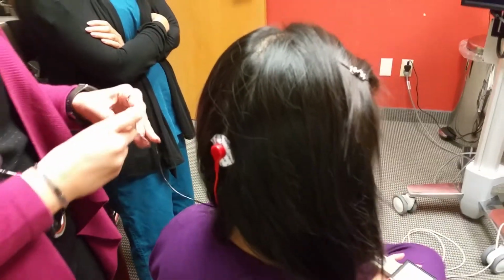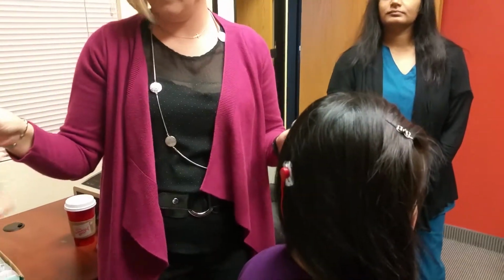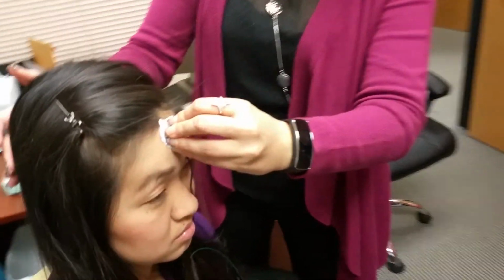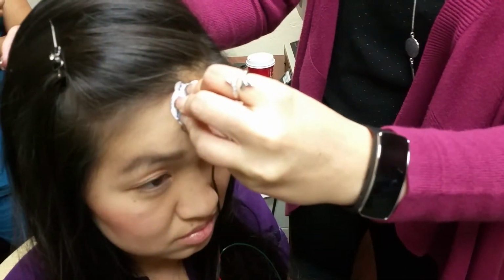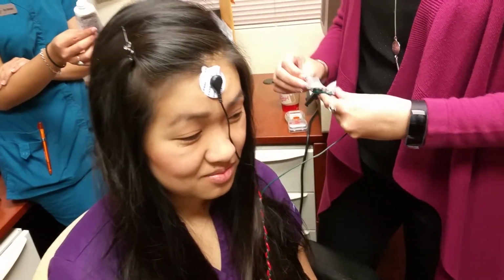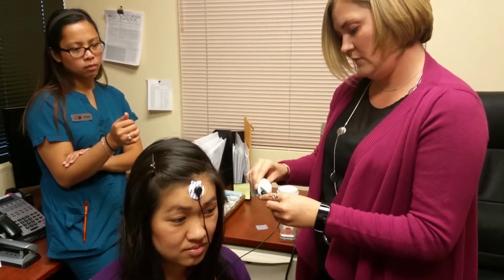The black one goes to the center of the forehead. Thank you, ma'am. So we want this one in the center of her forehead, right below her hairline. Again, all 5 fingers around. We're going to press and hold it. We don't have to wiggle this one. And then the green one is your ground wire. We don't want it on the temple, we want it on the bony process above the temple. You guys already know this, right?